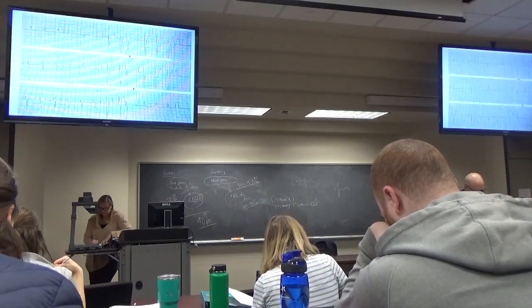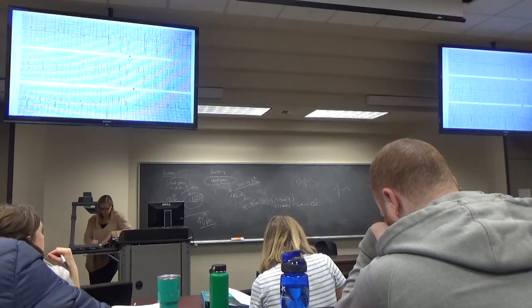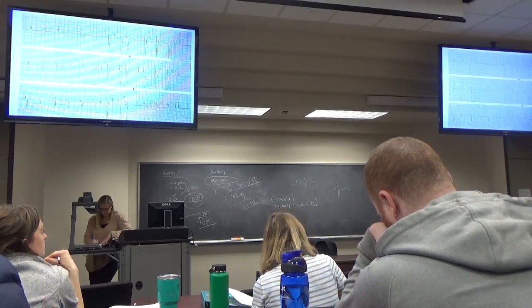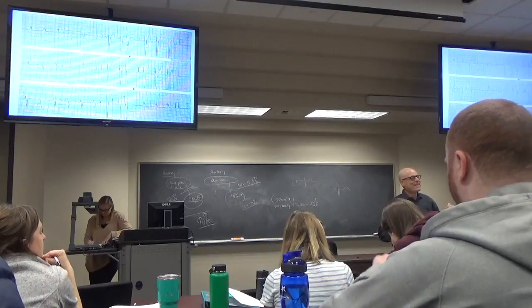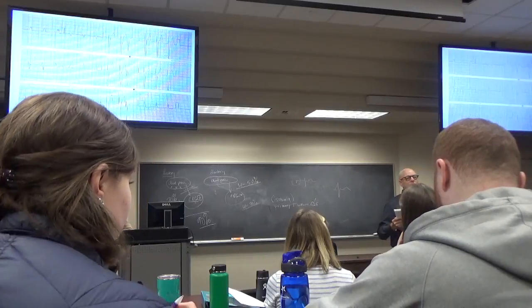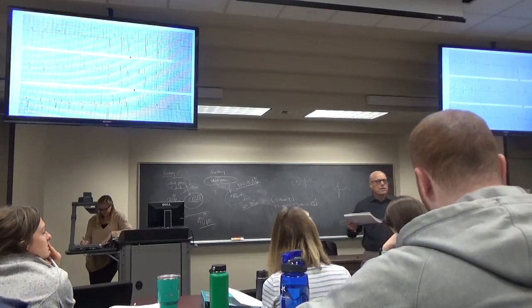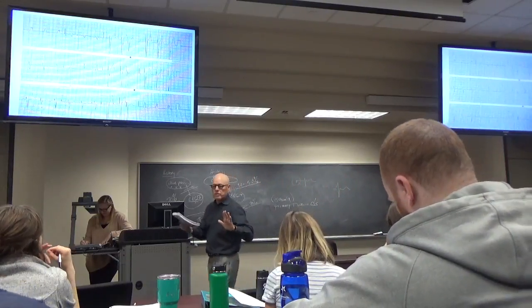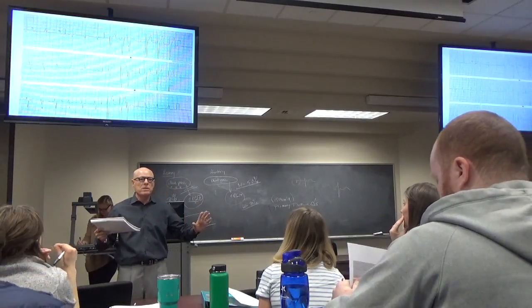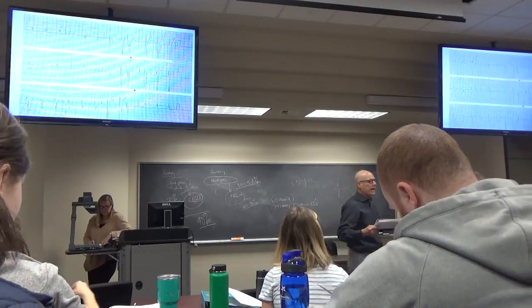Look at these two. It's on the borderline. If it's 0.2 or greater, it's first degree AV block. Listen to me. First degree AV blocks are common, benign, easy. Don't sweat it. If you called it 0.2 or greater, it's first degree AV block. If you called it 0.18, I'm not going to hammer you over it, and neither is anyone else. No one else is going to argue with you about it. You've got to sweat the heart attacks.